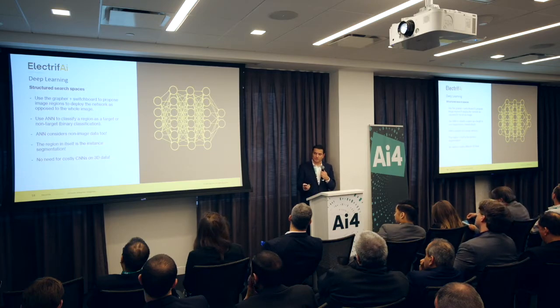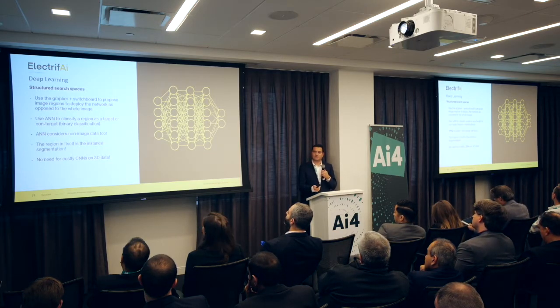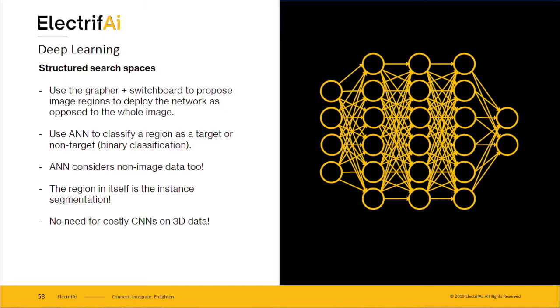And this does not require any costly CNN architectures on 3D data. It bypasses the problem of finding 3D annotated data, and in itself it produces 3D segmentation with a level of accuracy that you've seen before.